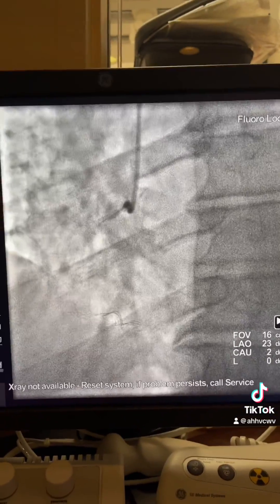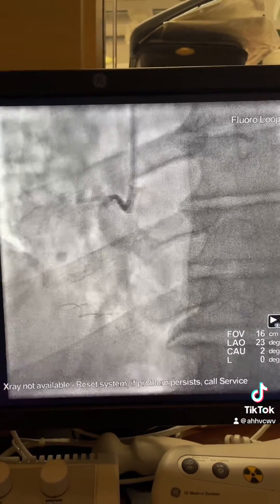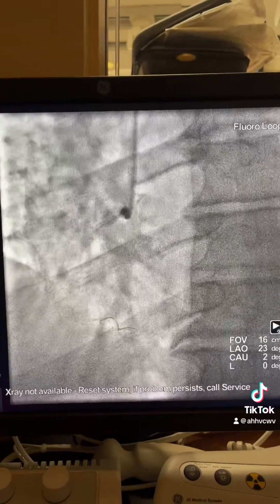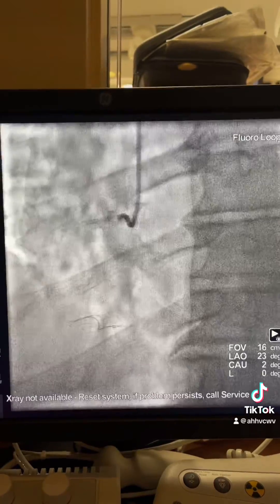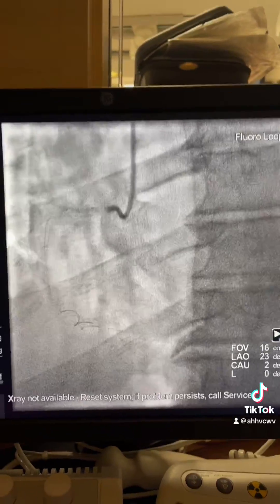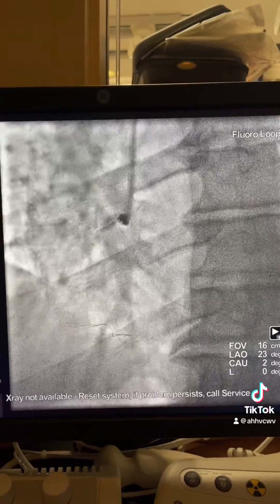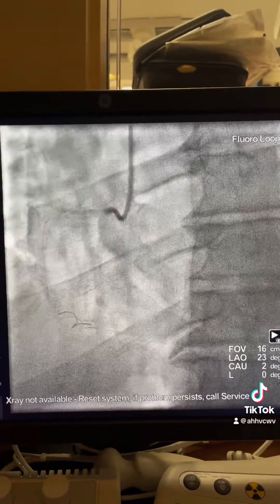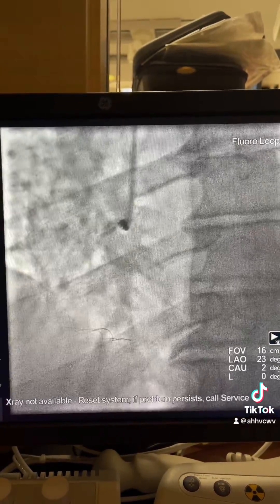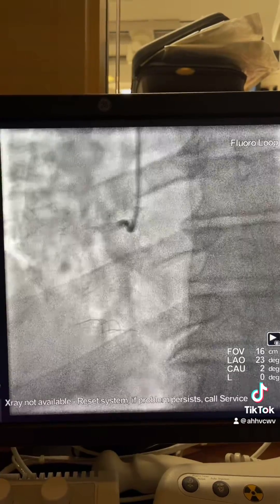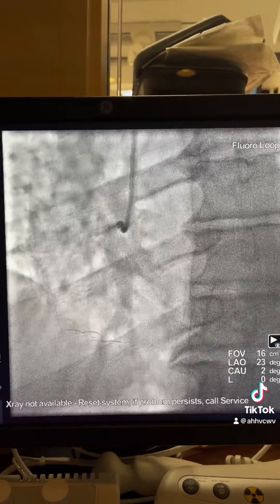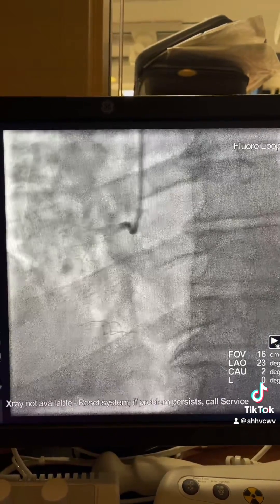As always, used a guide with good support — in this case AL75. Wire was PT wire, supported by a 2012 balloon.